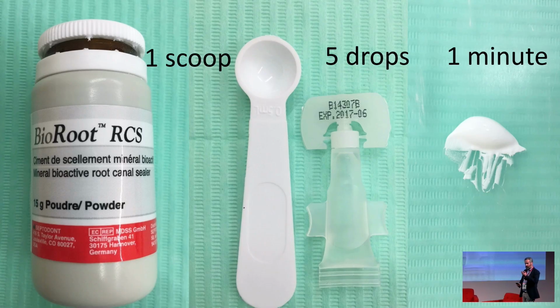We mix 1 scoop of the powder with 5 drops of the liquid. We mix for 1 minute, and we obtain a creamy consistency that we have to put inside the canal.